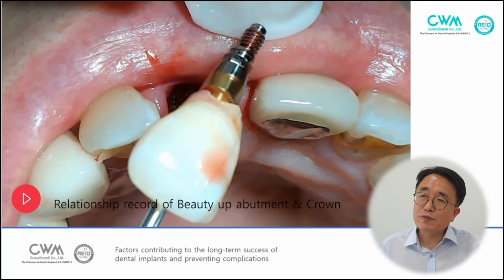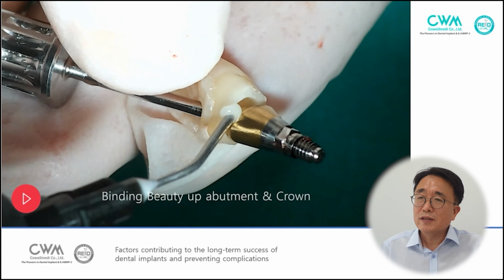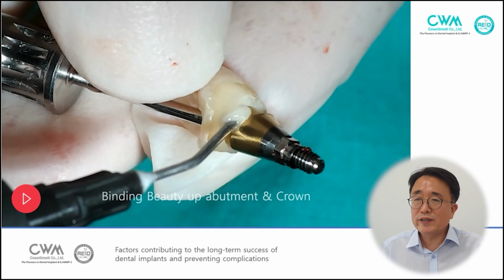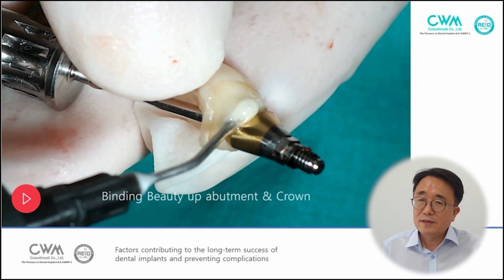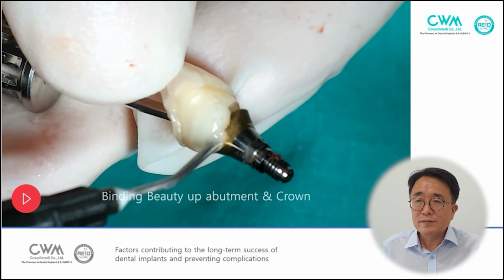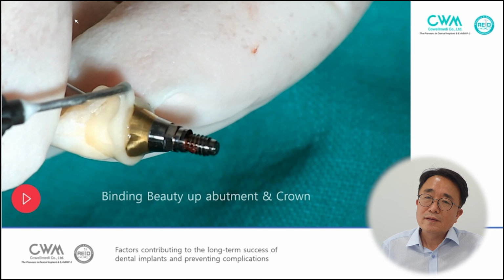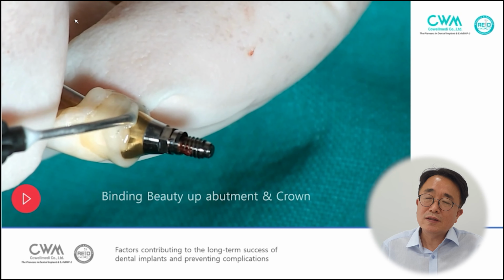The gap between the abutment and the natural tooth is filled with light curing resin. And then polish it, and adapt it again.